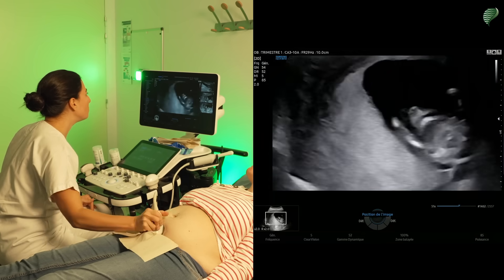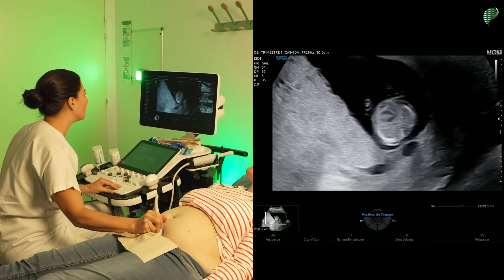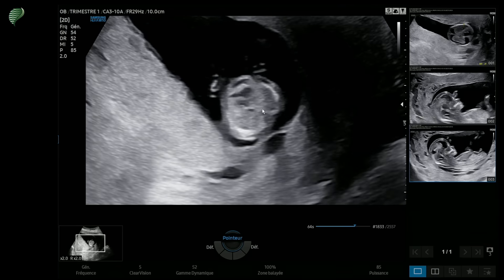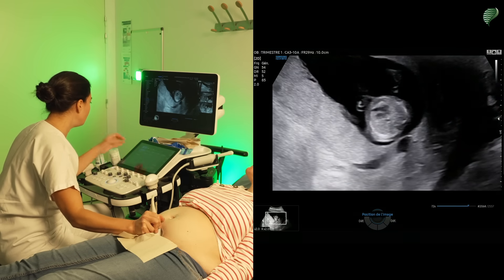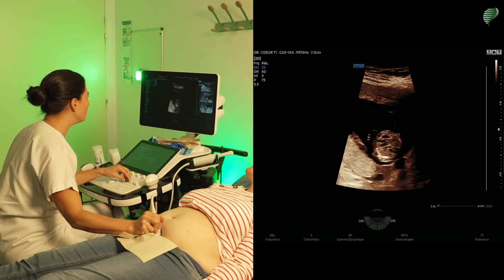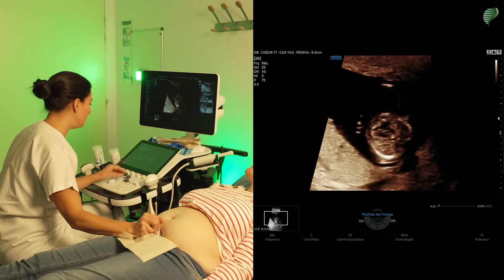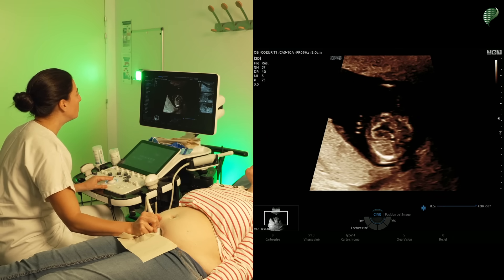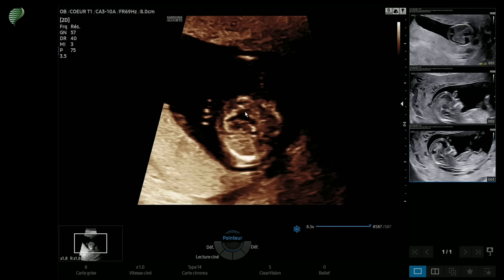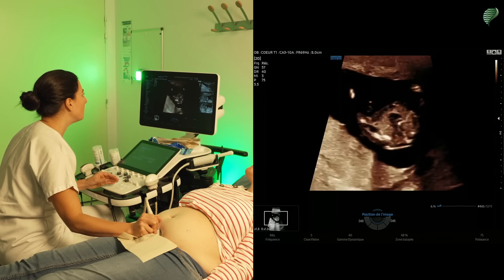Continuing from top to bottom, I'm now going to reach the thorax. At the level of the thorax we have the lung fields, which are homogeneous, and then we have the heart. I'll use a heart mode and increase the zoom, adjust the depth, and optimize the image. Here we see the orientation of the heart with its tip towards the left, and the four cardiac chambers with the two ventricles and the two atria. We're not obligated to go further when we're in the first trimester.